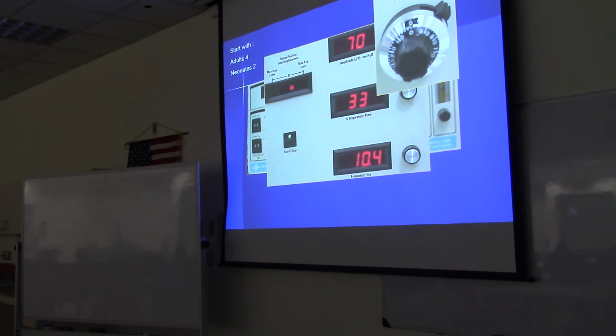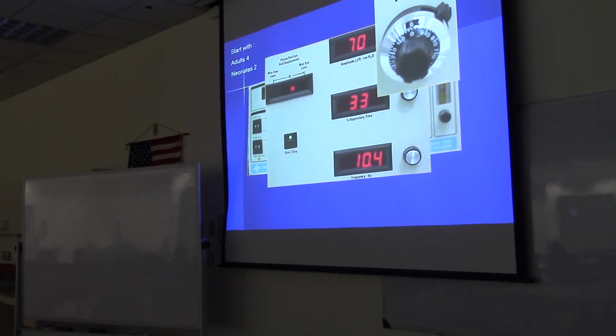Question? Yeah, that's the same for the high frequency jet, the wiggle, like they'll wiggle a little bit, correct? Because that's what we've been seeing in the NICU. They're documenting the wiggle with the jet? And it's only measured from their neck to the lower abdomen. If their other extremities wiggle, then the pressure needs to be decreased? Mm-hmm. Oh, okay. That's how they're measuring it.